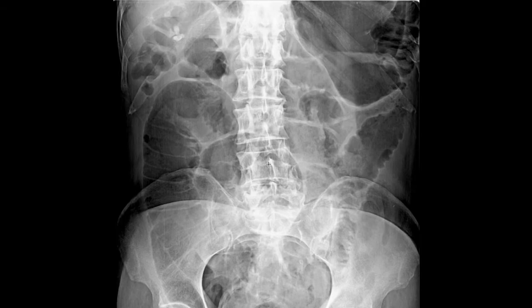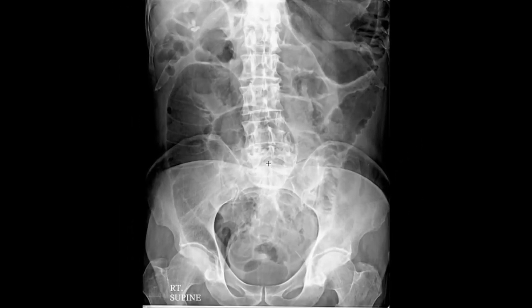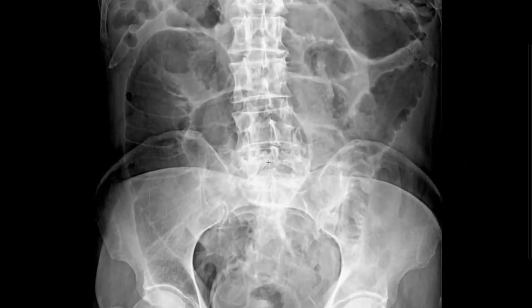Now, this is a very good critique within the image. Usually lateral deviation of the spine is diagnosed as scoliosis, but in the cases of bowel obstruction, the patients are really in pain. This amount of gas pressing against their abdomen and their backs causes excruciating pain sometimes, and the patient cannot really lie down easily. So it can be a positioning error, and it can be some scoliotic changes. This is not of significance right now, but it's just a point to ponder.